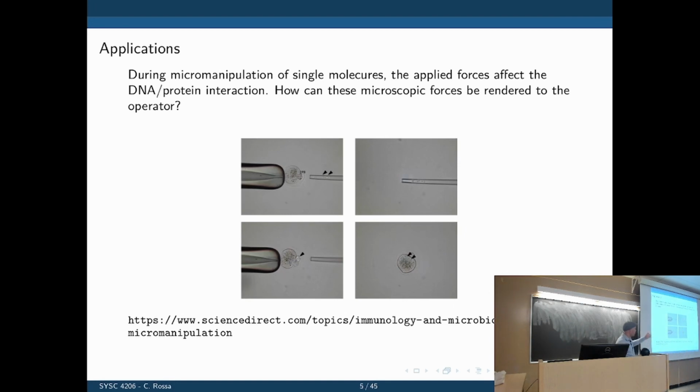The forces here would be not perceptible without amplifying them by a huge margin. Yeah. So you would put some sort of force sensor, most likely some sort of electrostatic sensor, because the forces are really, really tiny, and then you would amplify them by a factor of 100, 1,000, I don't know, to get something that you can actually feel on the haptic device side. All right.